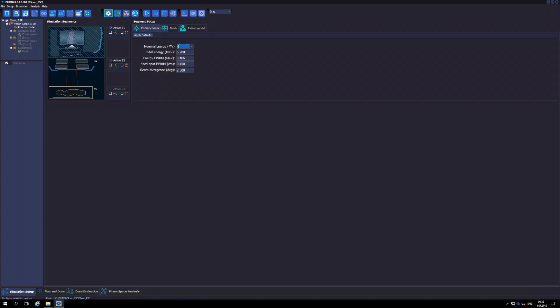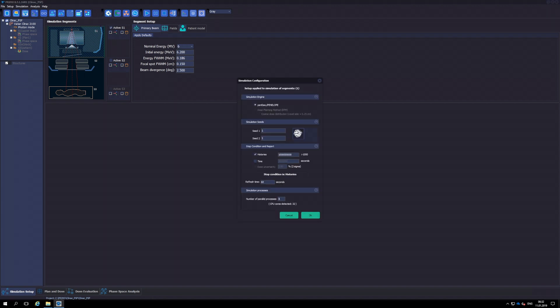Prior to launching the simulation, it is necessary to define the simulation configuration values. For the simulation of Segment 1, the only available Monte Carlo engine is Penelope. We will use the default seeds of the random number generator and we require that a time of 120 seconds will be the stopping condition of the simulation. This is an exceedingly short simulation time for Segment 1, but for the purpose of showing how the simulation is launched, it will suffice.